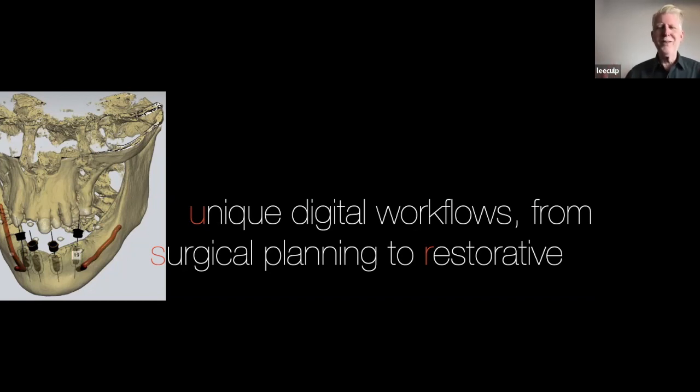I set the teeth on pure geometry with nothing. I had an upper arch and a lower arch, and basically perfect every time. So anatomical landmarks and going through a process of measuring averages actually gets you really, really close.